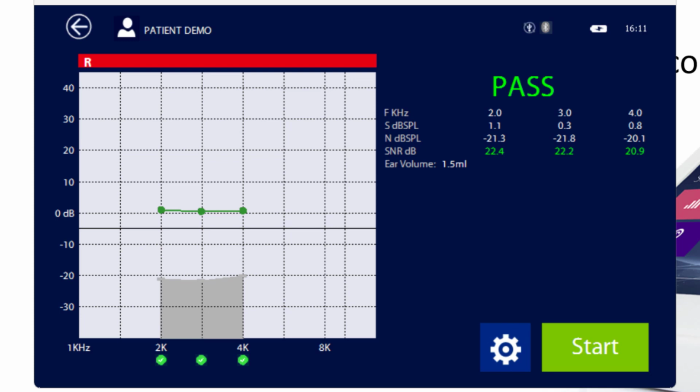So what you saw here is that during the calibration, you get the 2 curves on the screen, the same ones as during the probe check. Then afterwards, you jump to testing the frequencies that were selected for testing. Actually, there is a 4th frequency selected, but we never got to test it because the first 3 were already a pass, and it will stop when 3 out of 4 are a pass.